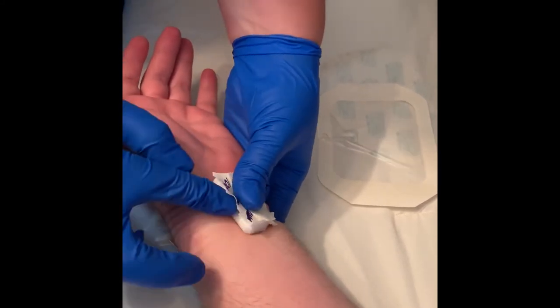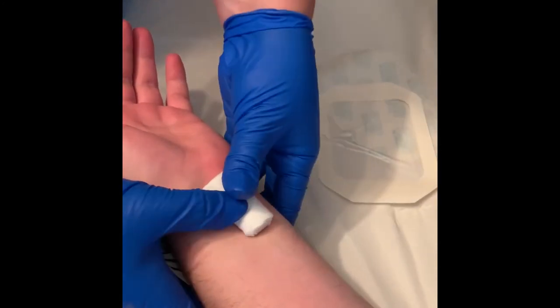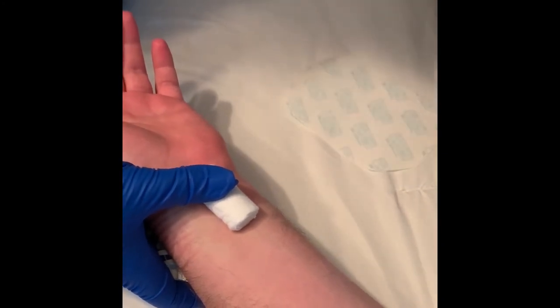Separate the bandage from the roll, ensuring you are holding it over the site without disturbing the clot. Cross off time number three, then apply the Tegaderm over the roll.